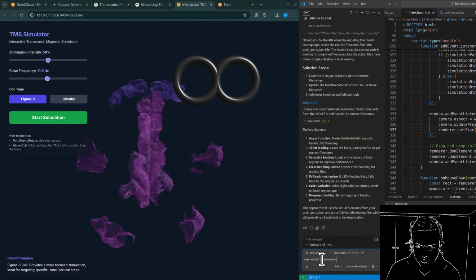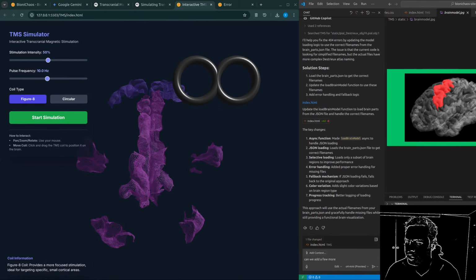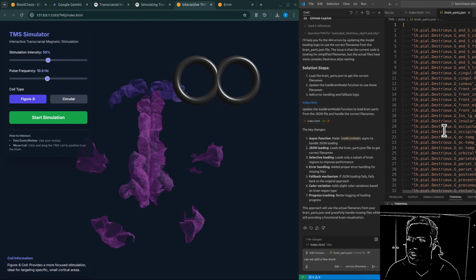Right. Another tool mentioned is SlicerTMS. It's also open source and apparently offers more real-time visualization capabilities. Real time. So you could potentially move the virtual coil and see the E-field change. That's the idea, yeah.